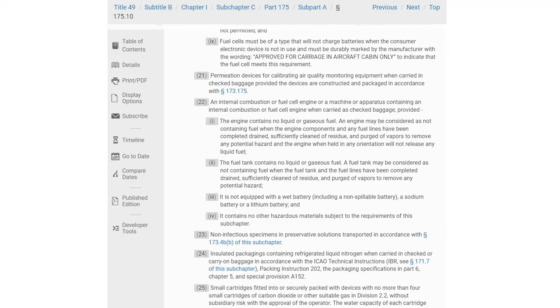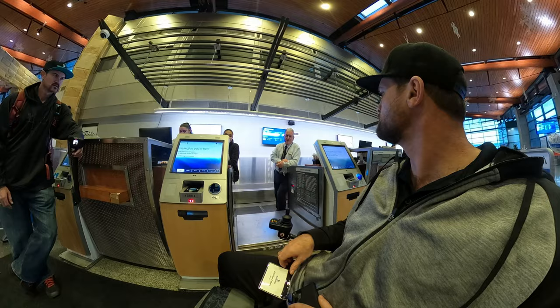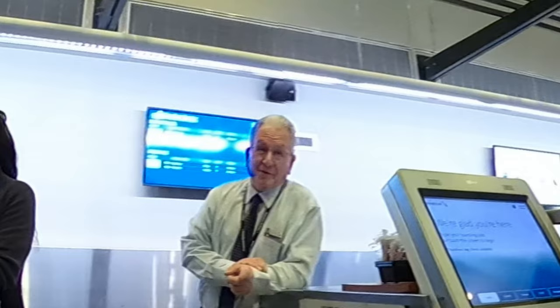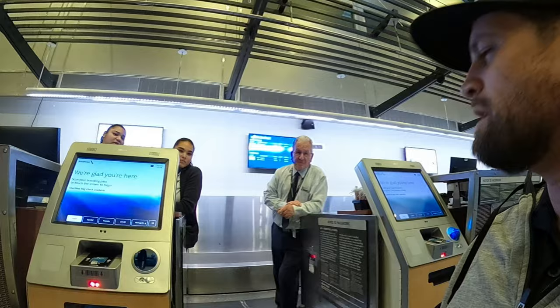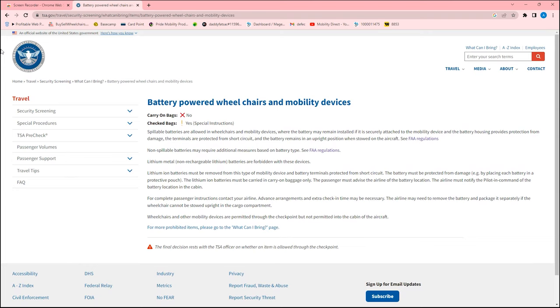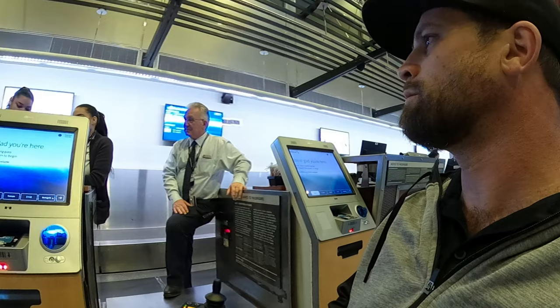Because I think we have a limit. 300. It's a TSA maximum. We're doing an ADA audit, so we know American Airlines is very accommodating. That has to be carried on board. That's going to go in my bag, yes, sir. It's going to detach. Are you going to need that at your final destination? Yes, I will need it at every gate. So basically, I'll go up to where the stroller goes, you guys tag, and then I pick it up between each flight. Yes. And these are the requirements by the TSA regarding battery-powered wheelchairs and mobility devices. This coincides with the FAA's rules and regulations regarding sealed lead-acid batteries and lithium.